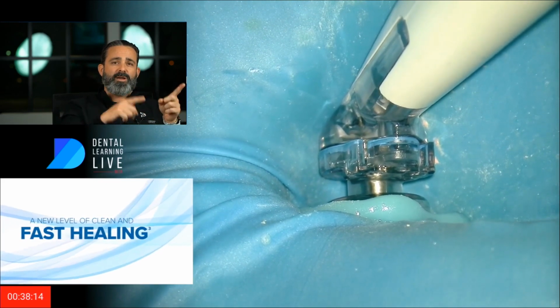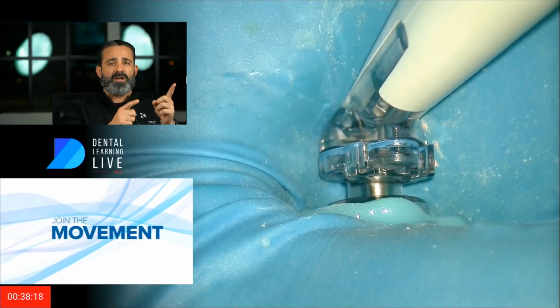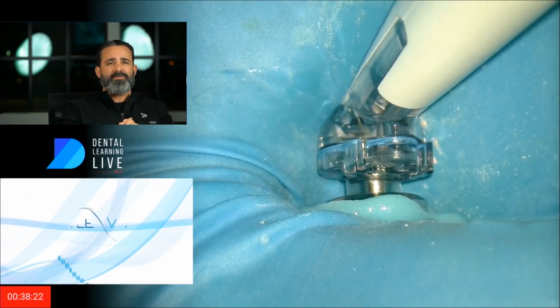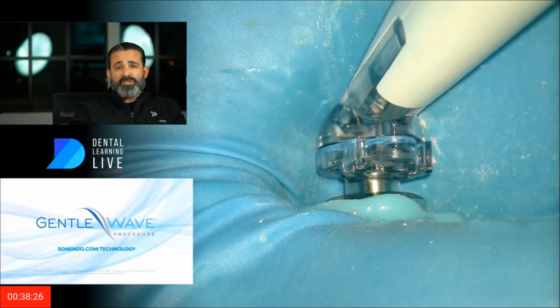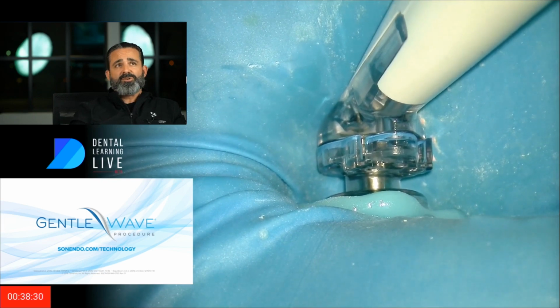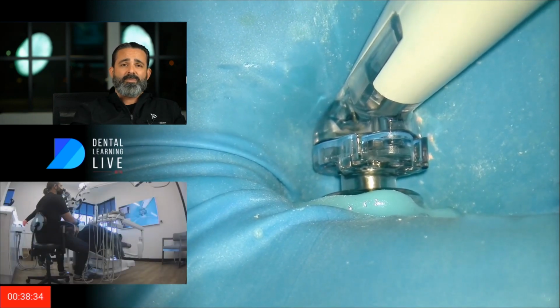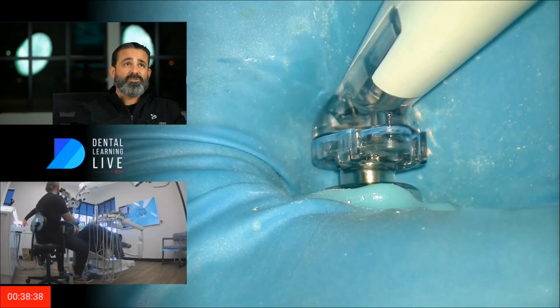Now, you've probably seen my videos before, and that's an explainer video that I didn't talk through. But I wanted to really focus on those other principles because I haven't talked as much about that. But the GentleWave technology is real, and the fluid dynamics are real. And it is generated in this procedural instrument. And as such, I feel steward of that procedural instrument in my hand. I want to keep it on the tooth, and I want to watch it.